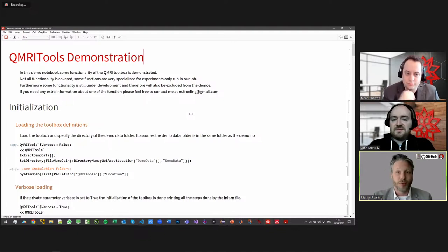And so we typically don't really take one picture, but we take an entire range of pictures, and then we apply models to that. And that MRI data, of course, when you take a picture of the body, the information you measure is actually placed in world coordinates. So we have the body anatomically correct, so we can also infer something macroscopic from how a muscle is built up, how it's related. So those are the things we do.